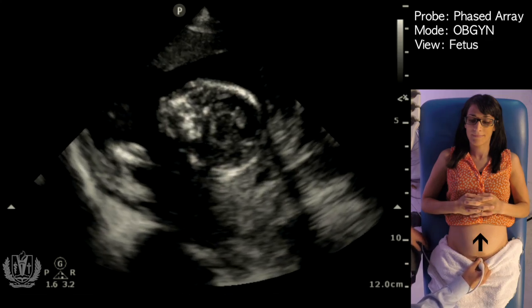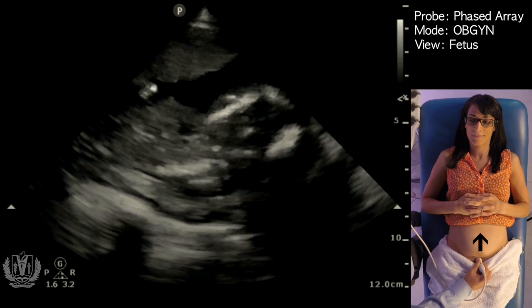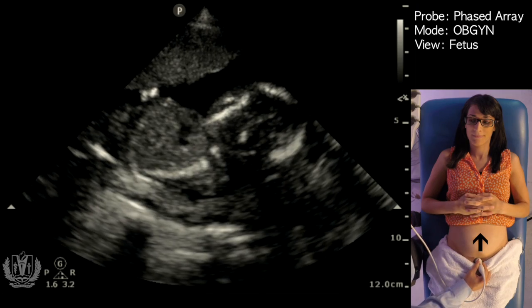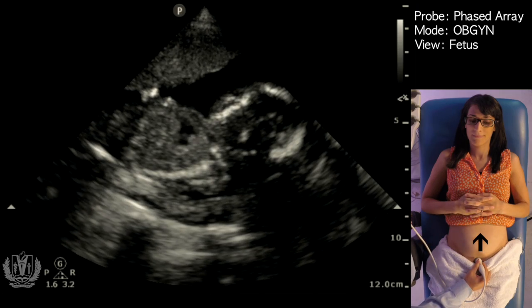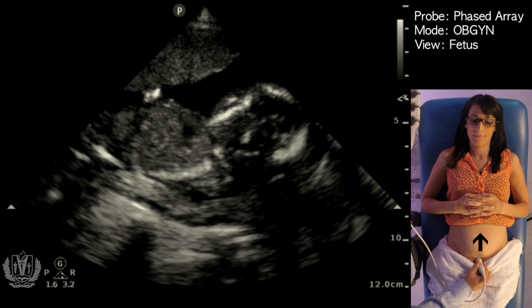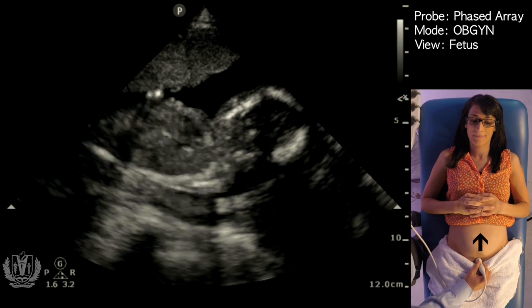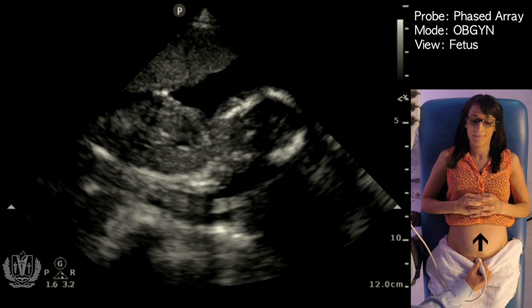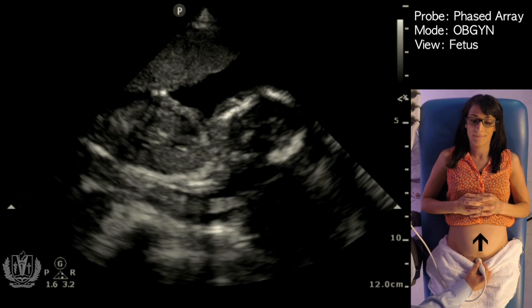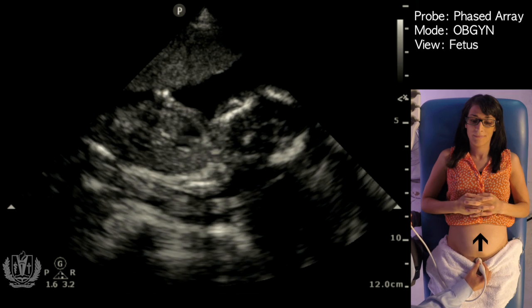Another component of the obstetric ultrasound is looking for fetal motion. We can wait to see if the fetus moves. And right there you can see some fetal motion. You can also identify the fetal heart.